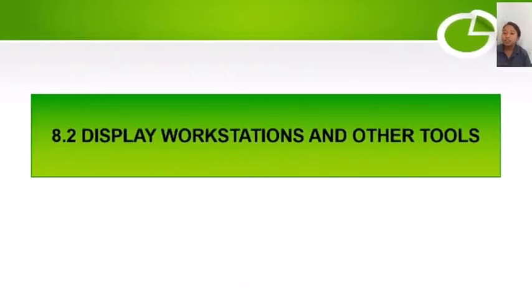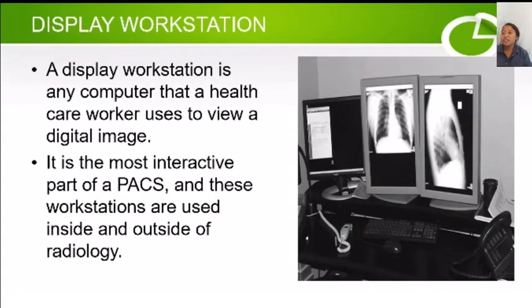Display workstations and other tools. A display workstation is any computer that a healthcare worker uses to view a digital image. Here is an example on the screen. It is the most interactive part of a PACS, or picture archiving and communication system, and these workstations are used inside and outside of radiology.